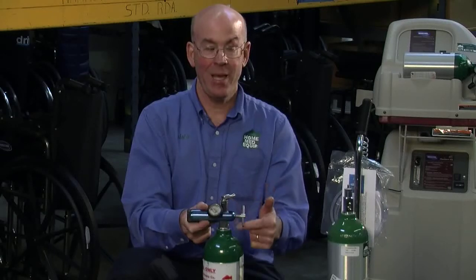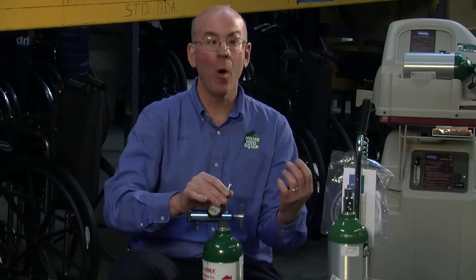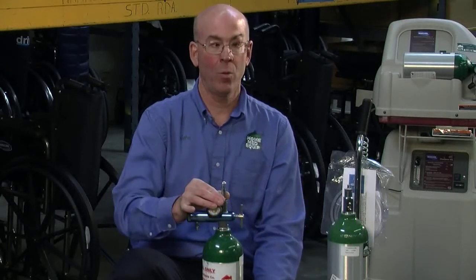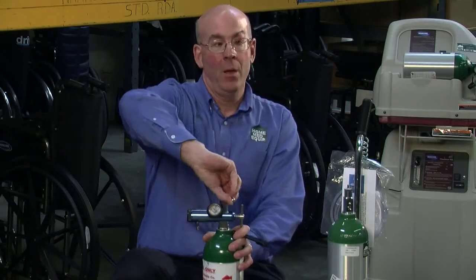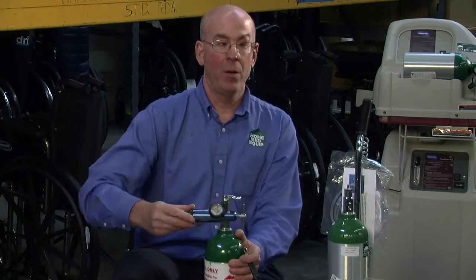Then take the T and thread it until it's finger tight — it doesn't need to be any tighter than that. To check your work, open the cylinder, depending on whether it has the wrench feature or the built-in toggle. Turn it counterclockwise to open and let the oxygen into the regulator. If you hear no hissing, you've done the job. At that point you can set it to your prescribed liter flow.